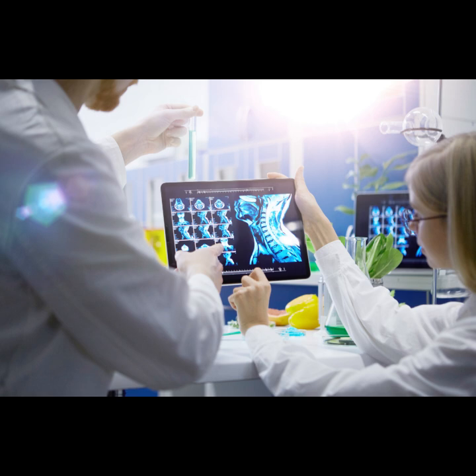Before that T2 decay, or actually something called T2 star decay, makes the signal vanish into noise. T2 star. What's the star? Good question. T2 is the inherent natural dephasing due to random spin-spin interactions within the tissue. T2 star includes that, plus dephasing caused by tiny imperfections or variations in the main B0 magnetic field itself. It's always faster, meaning the signal disappears even quicker in reality. So the clock is ticking even faster than we thought. Milliseconds, maybe? We're talking tens to hundreds of milliseconds, typically, to get the useful signal. That's the window we have to work with.